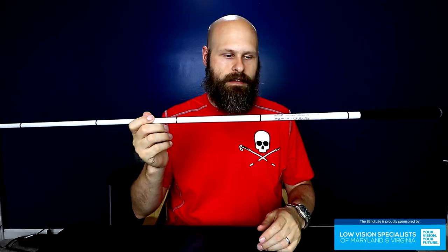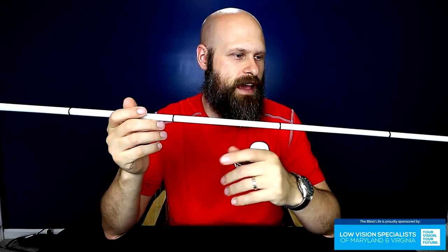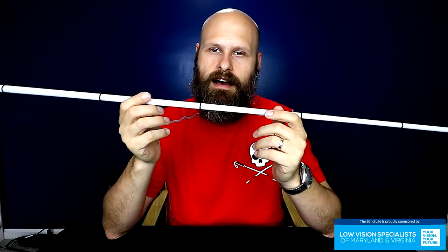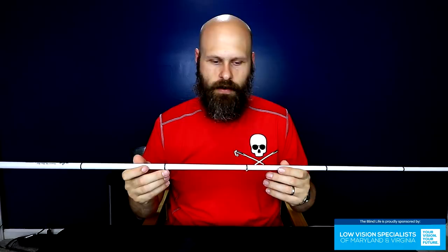If you don't currently have a cane and you're thinking about getting one, you can get them in lots of places. Amazon has a ton of different canes. Ambutech is another company that makes canes. If budget is a concern, you can go to nfb.com and submit a request to get a free cane — they feel that anybody who needs a cane should be able to have one regardless of income. So if you need a cane, be sure to get one.